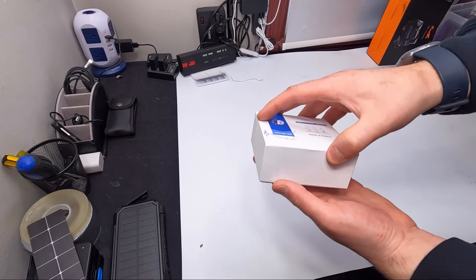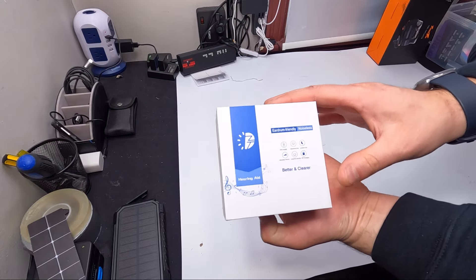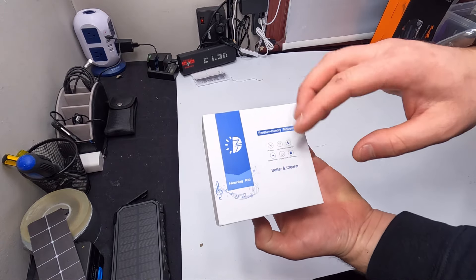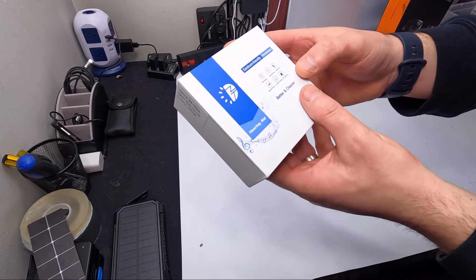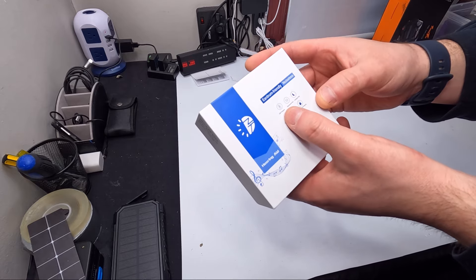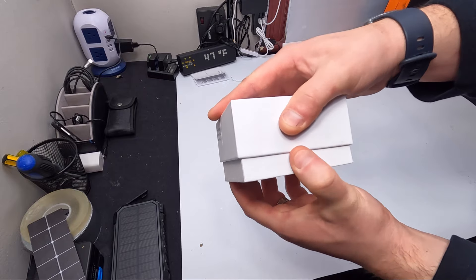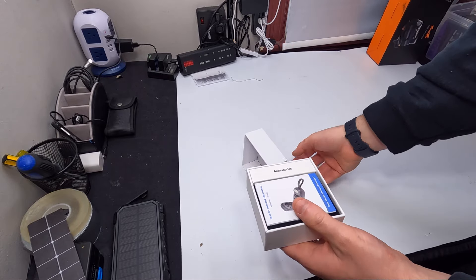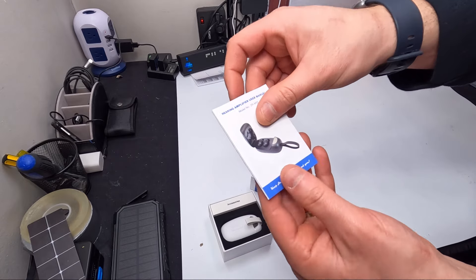Hello my friends, welcome back to another unboxing video. For today's video we're checking out these hearing aids. They also have noise canceling, so there are multiple uses. You have long standby time, you can adjust the volume, USB charging, compact size. These would be for someone with bad hearing — they amplify sound or work as a noise canceler.